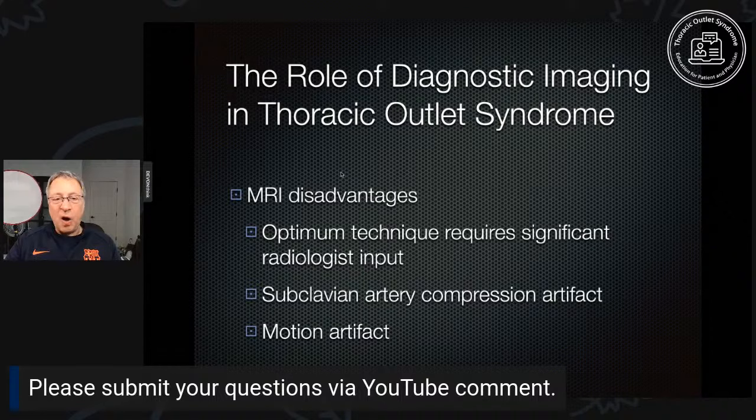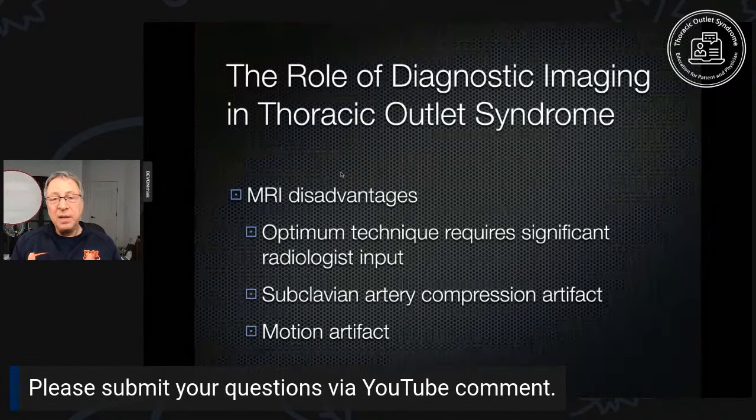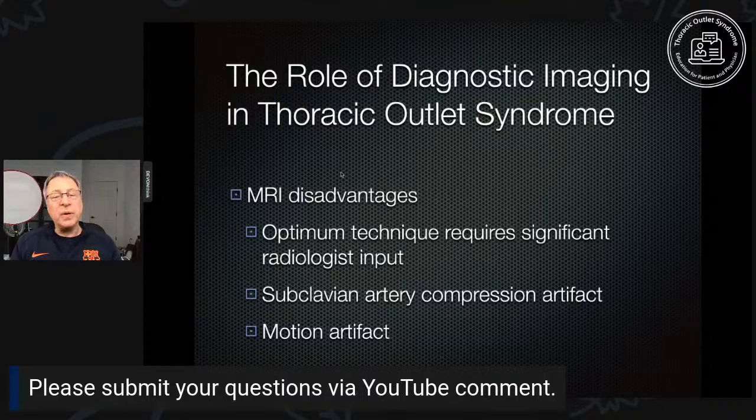The disadvantages are, number 1, it's a very complex technique. The technique I've developed, for instance, has taken a lot of time to develop and refine and keep improving. So just having a technologist isn't enough. You need a radiologist to work with a technologist to make this study really sing and show all this great detail. Secondly, there is an artifact that occurs when you inject the dye into the vein in your elbow.